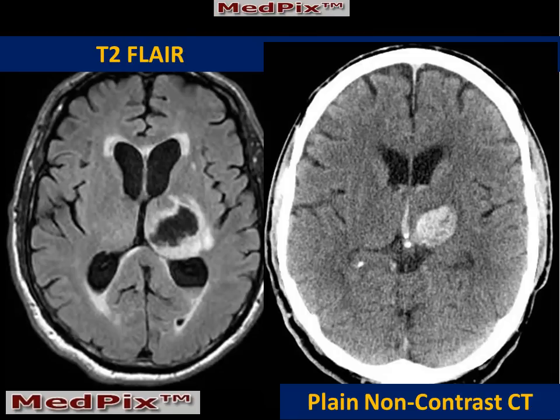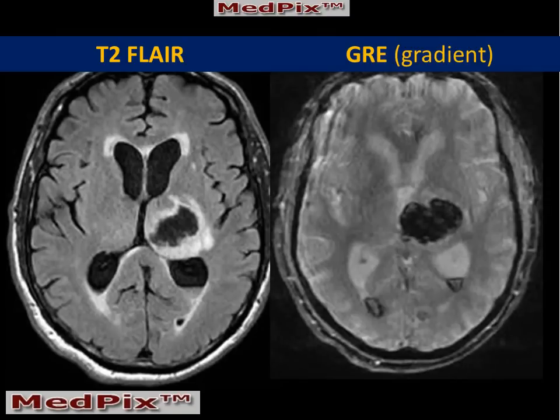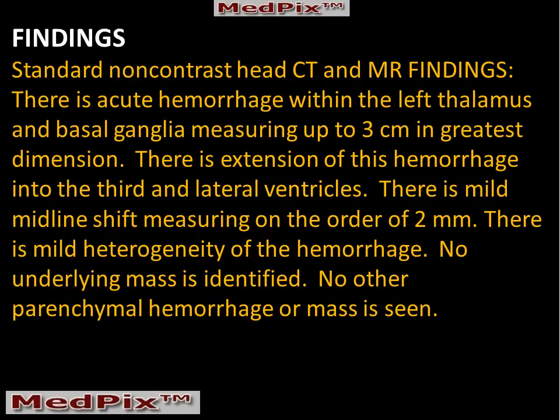The MR scan demonstrates a heterogeneous lesion in the left thalamus with an appearance consistent with acute hemorrhage. In addition, the gradient image confirms a susceptibility change due to acute hemorrhage, as well as blood being identified within the dependent portions of both lateral ventricles.